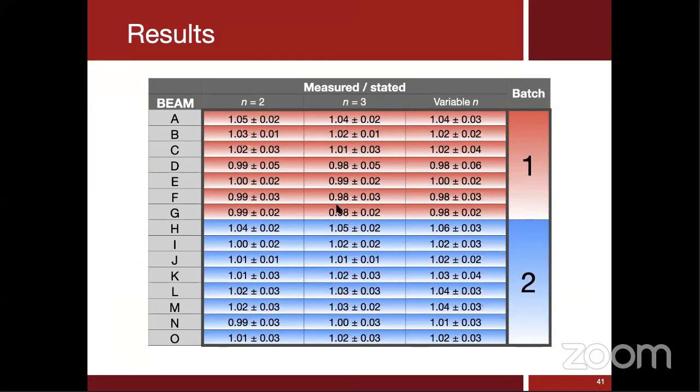After we did this experiment, we asked our colleagues and friends to shoot and report the dose to the film, and we checked whether the reading confirmed what they thought they were delivering. We got a very reasonable, desirable agreement.